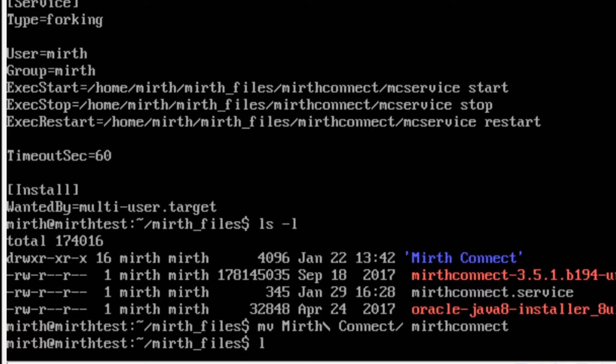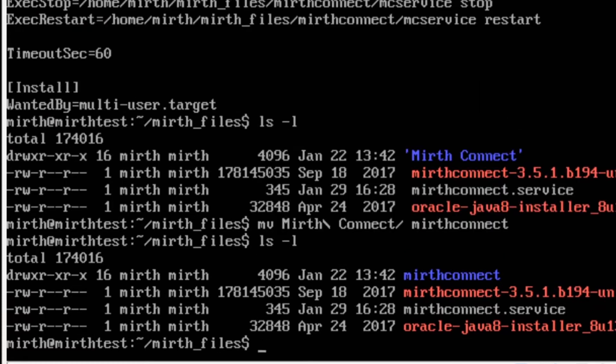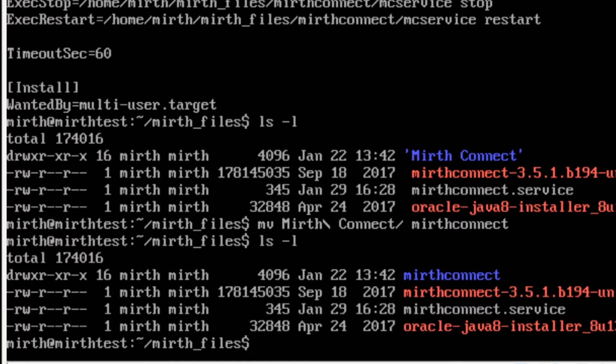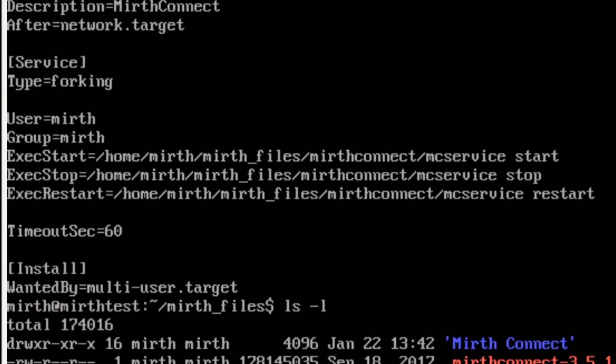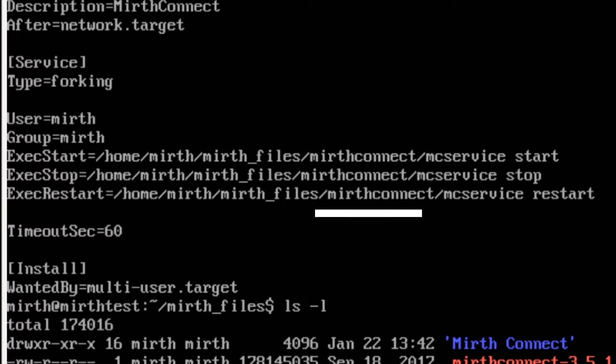Now if you do ls -l again you can see our folder has changed from MIRTH Connect to just mirth connect with no spaces, no uppercase characters. And if you notice where we catted the service file, we already have it set up in here that systemd is going to be looking for this path with our renamed folder. So this is going to work. You can see this is the absolute path of the service that it's going to be looking for.